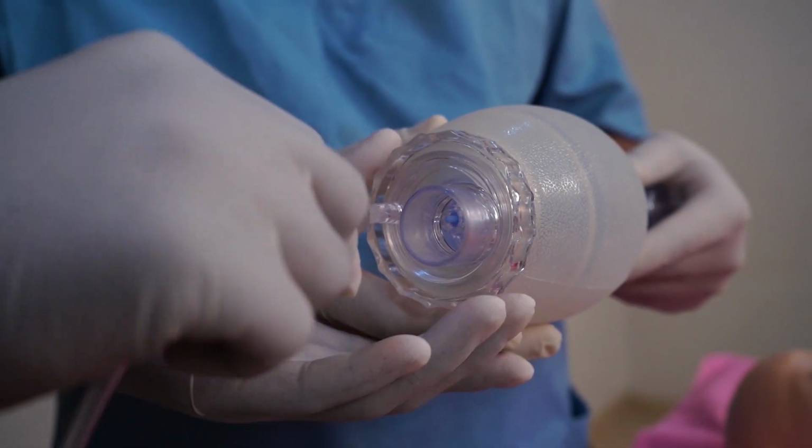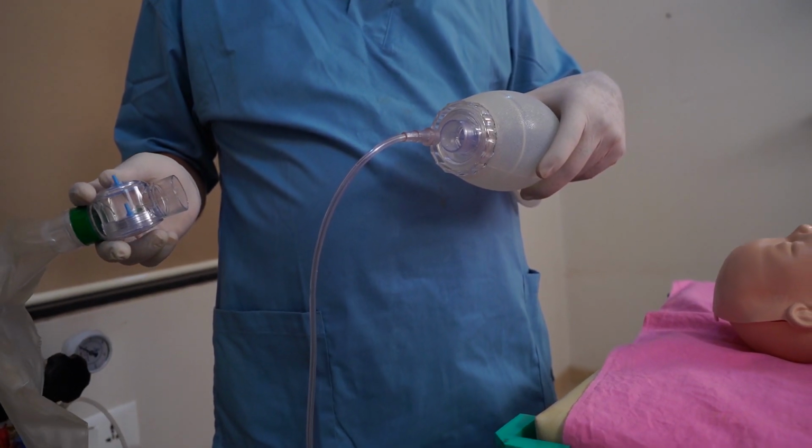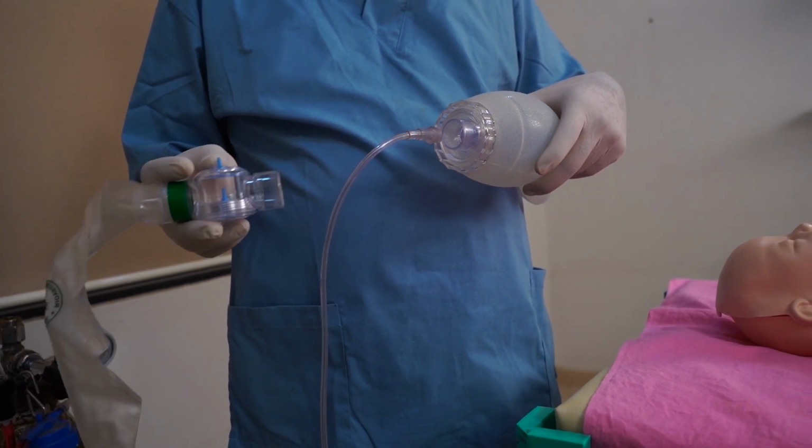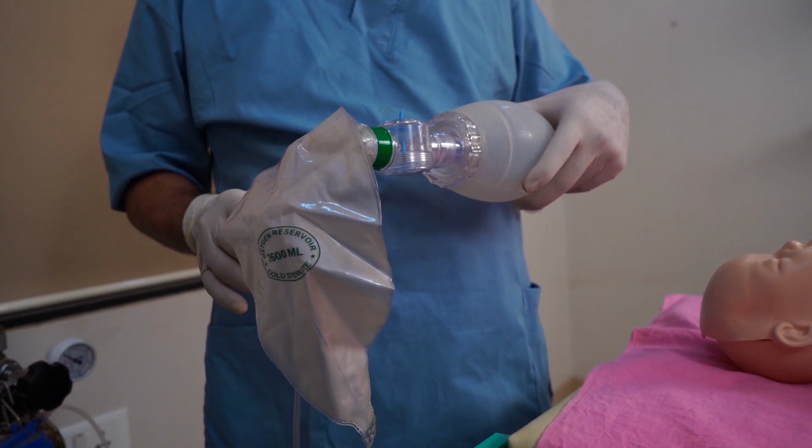Balwant, attach the oxygen. If more than 40% of oxygen is required, then only attach the reservoir. Otherwise, ventilate without the reservoir.